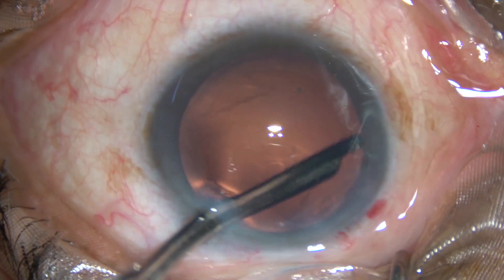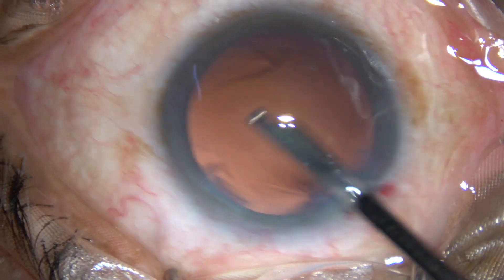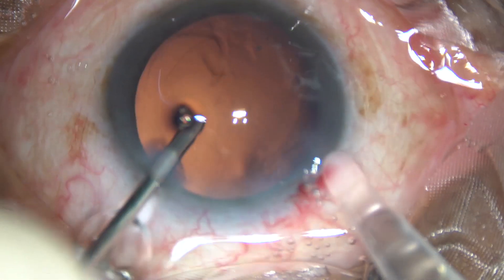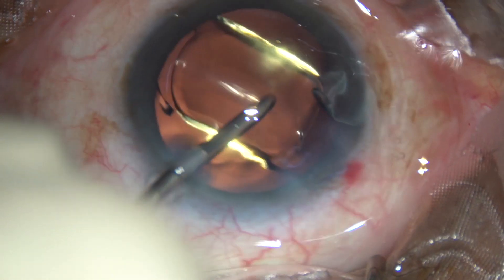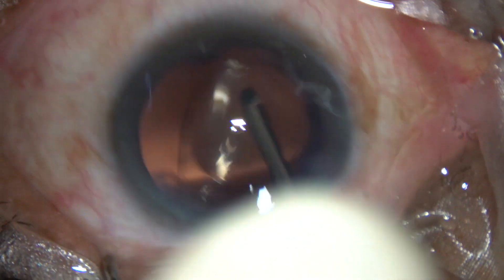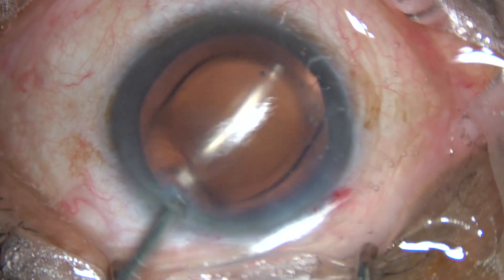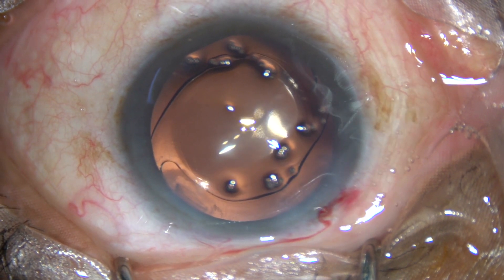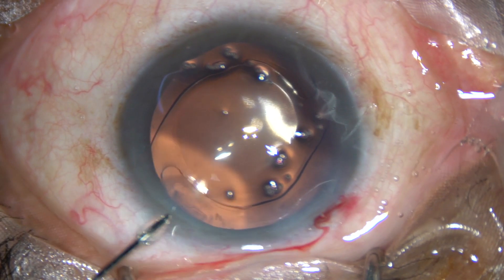The posterior capsule is clean. There are no cells on the posterior capsule in this case. We have decided to place a hydrophobic acrylic intraocular lens under irrigation. Here goes the intraocular lens. The irrigating probe places the lens in the capsular bag, dials the lens, and that's it. Since the lens has been implanted under irrigating fluid, keeping the anterior chamber formed under irrigation, there is no viscoelastic substance in the anterior chamber, so a lot of time which is spent in cleaning out the viscoelastic substance is saved.